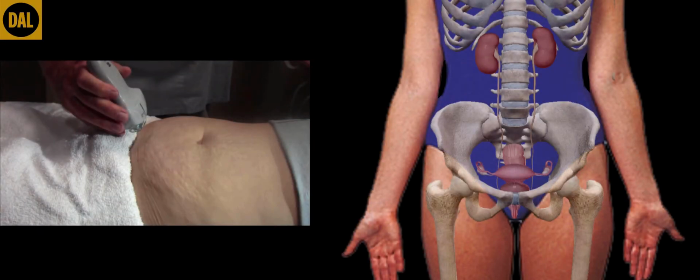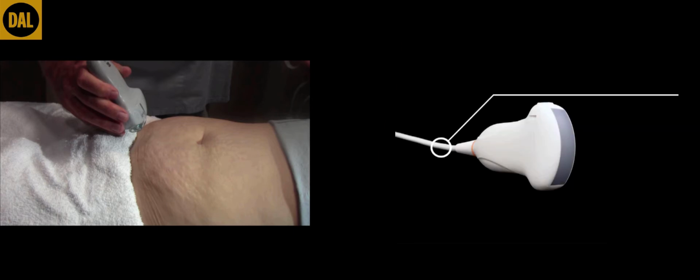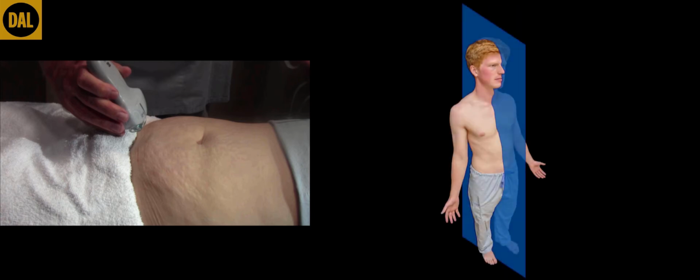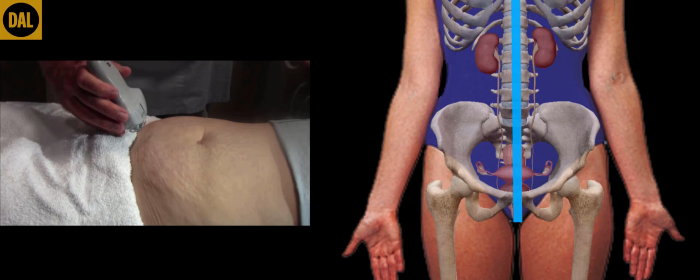In this video we will be doing a scan of the female pelvis. For this scan we will be using the low frequency curvilinear transducer. This scan is performed in both the transverse and the longitudinal planes. Initially, the transducer is placed in the transverse plane in the midline as close to the symphysis pubis as possible.